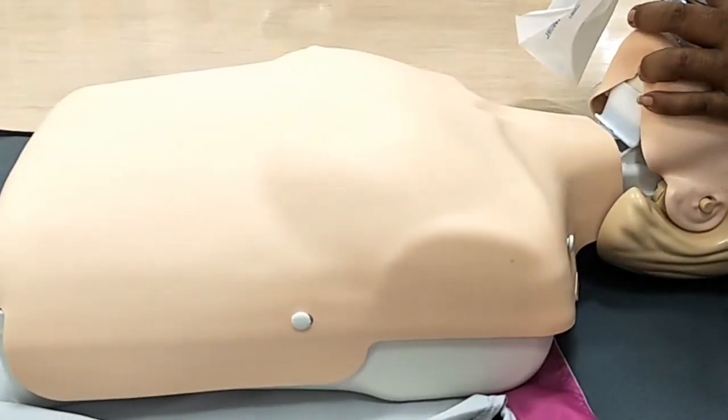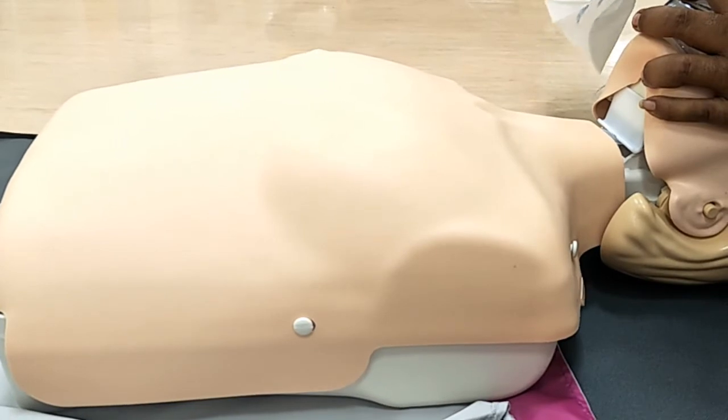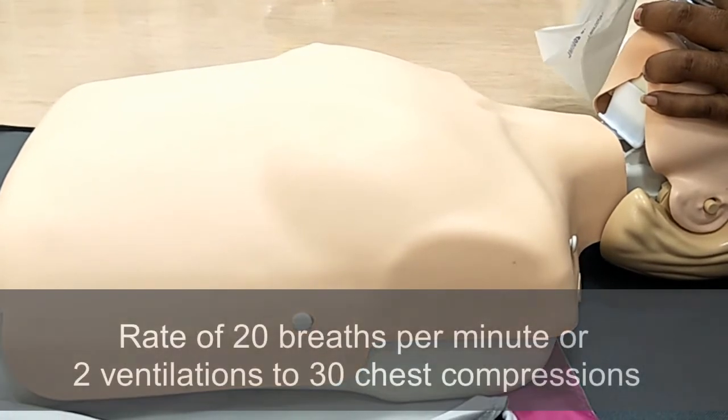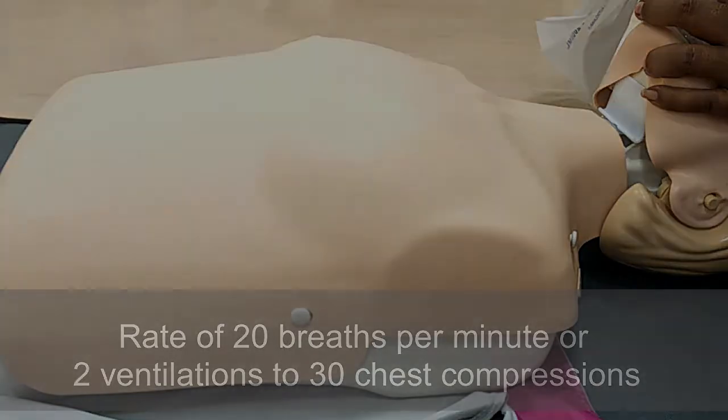Look for chest movement. If the chest is not moving, consider adjusting the head extension or repositioning the mask. Ventilate at the rate of 20 breaths per minute or at a ratio of 2 breaths to 30 chest compressions.